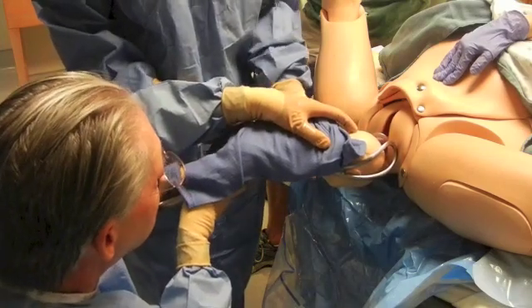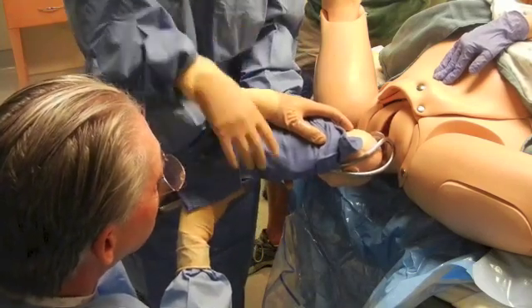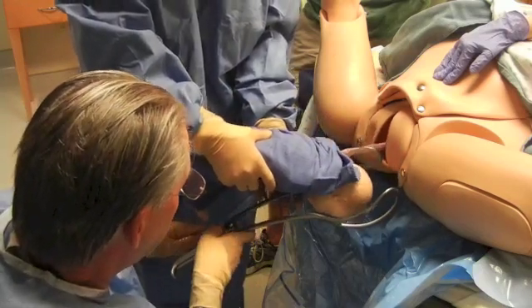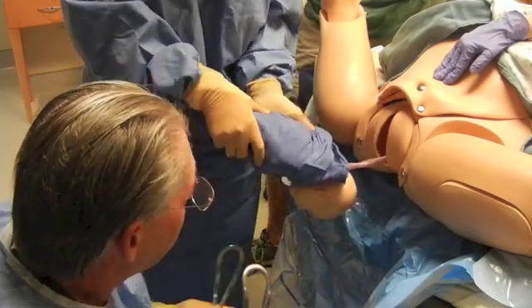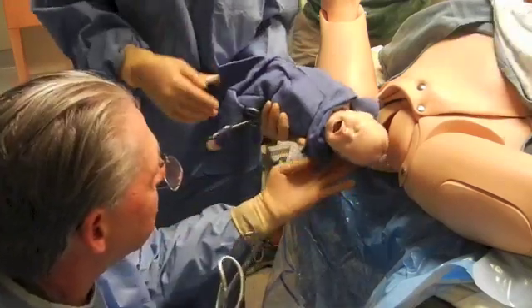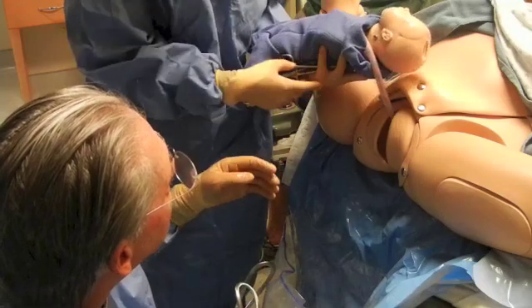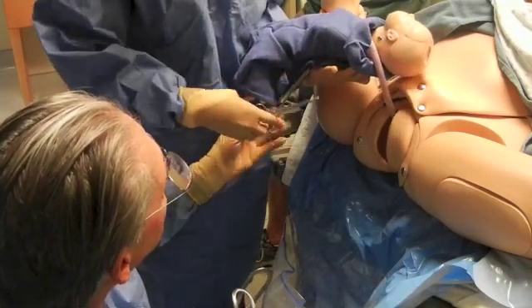Now you can assemble and do the resuscitation. Take the forceps away, support the head, unwrap the blanket, and we're all set.